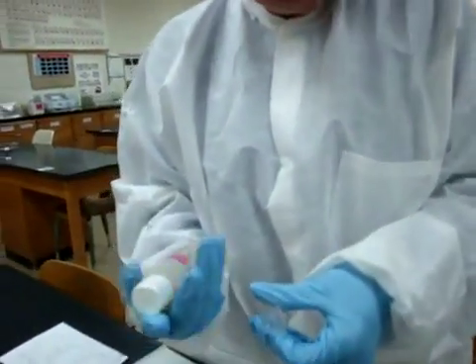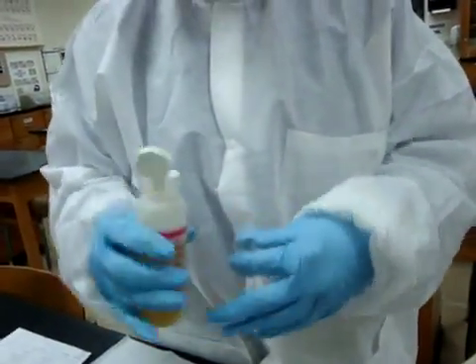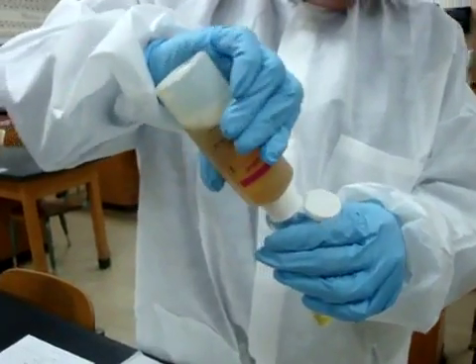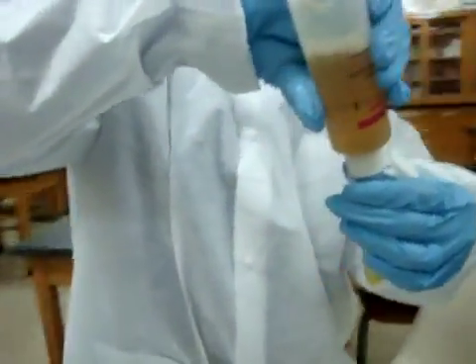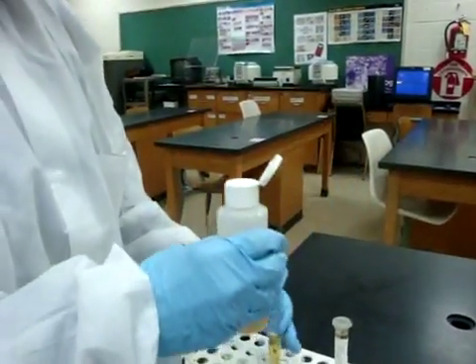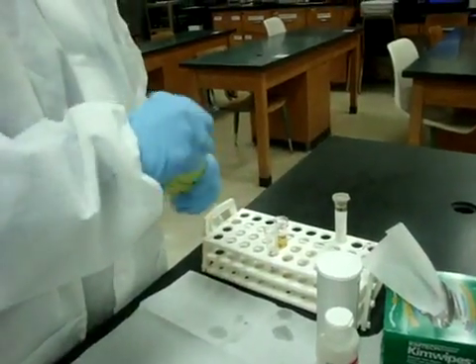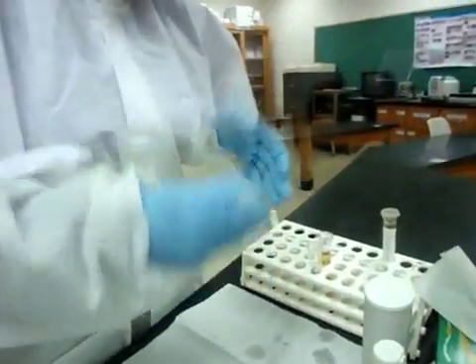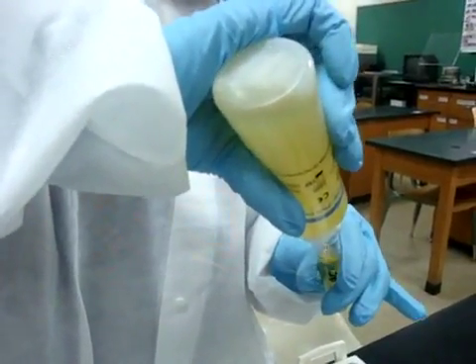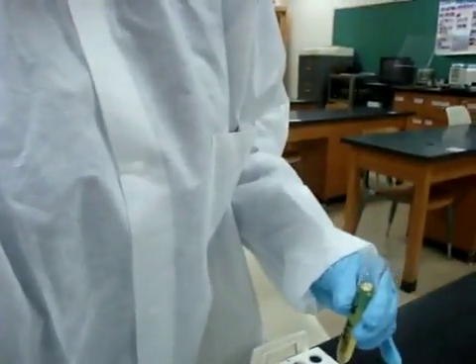This is the number 2. This is positive. I want to put about 10 mL of fluid in here. And then I want to do the negative. Then I'm going to add about 10 to 12 mLs of the negative quality control.